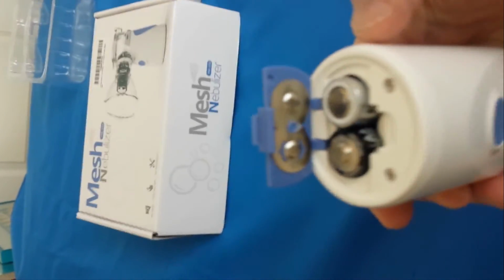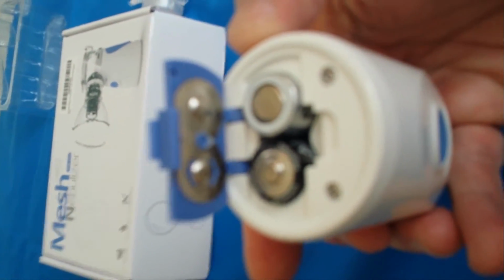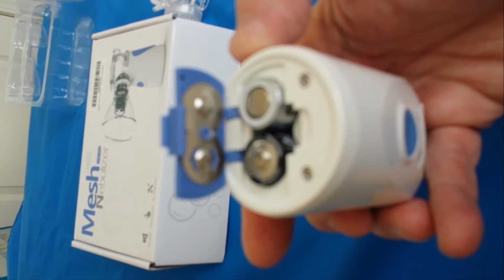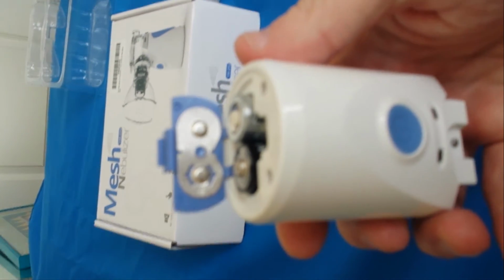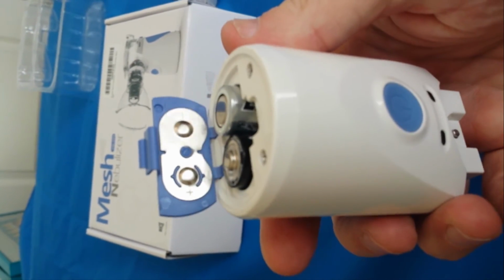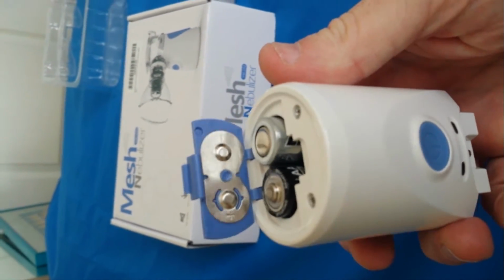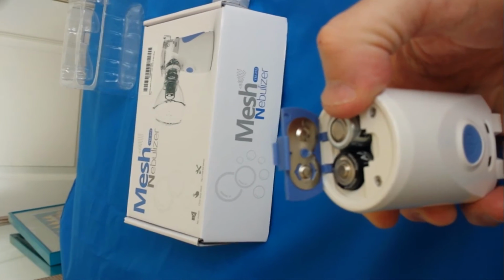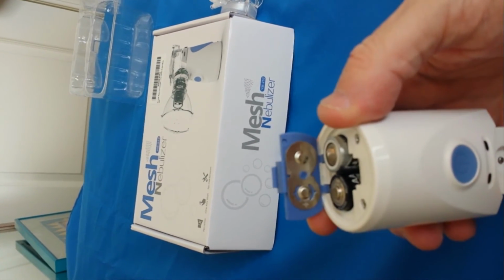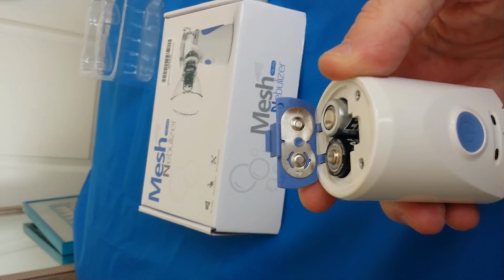Now the batteries are inserted properly right now. As you're facing it with the blue piece upwards, you will see that the left-hand side has that little nib on it, which is the plus side. You can also see on here, as the light hits it, there's a plus on the left-hand side, and then the negative is on the right-hand side, which is the flat portion of the battery. So on this side, the flat will be on the upside. On this side, the little nib will be on the upside, indicating that it is the plus.